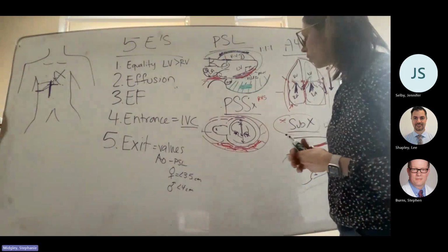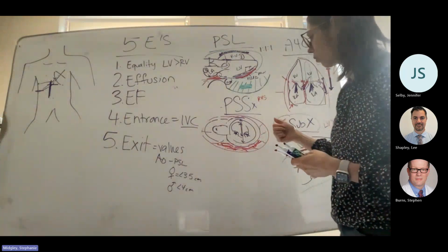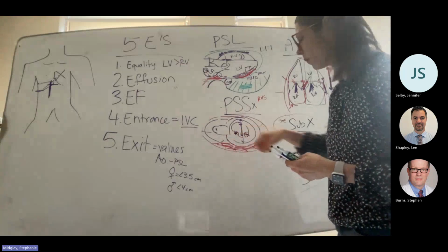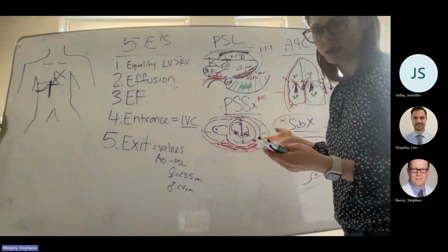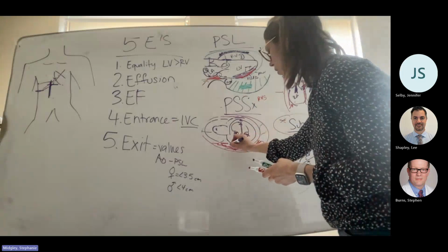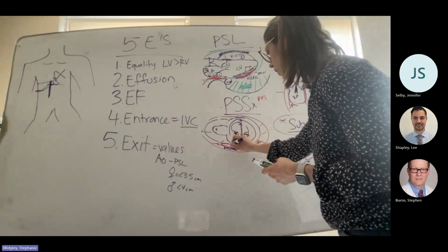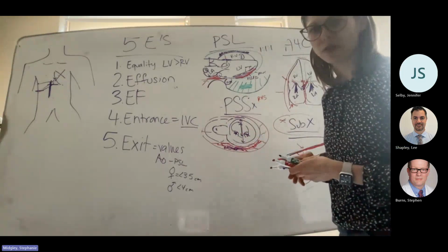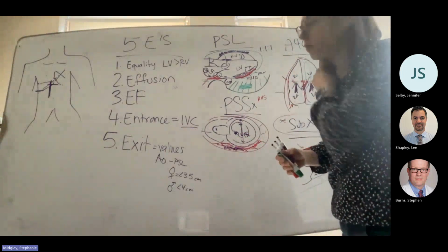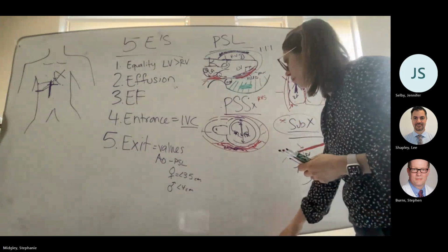If there's blood, so hemopericardium, you can get it with free wall rupture from MI, aortic dissection down into the pericardium, or obviously trauma, like a stab wound to the chest. You're going to see tissue dense looking stuff sort of floating in there. When we're done with the lecture part, I'll pull up some images and show you guys some.